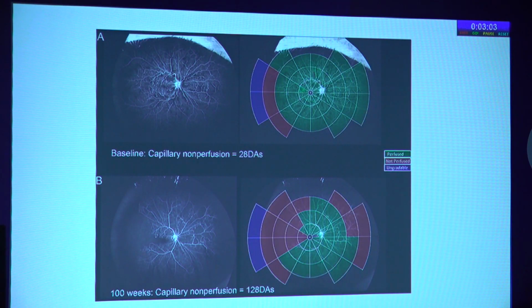Then in cases of central retinal vein occlusion, it is always a debate of non-ischemic versus ischemic CRVO, and the major differentiating point is, apart from clinical features, angiography helps here. Over a period of time, it is called 90 days glaucoma, neovascular glaucoma. If it converts from non-ischemic to ischemic CRVO, then you have to keep on continuously monitoring whether it is converting into ischemic changes, and this can be mapped on the photograph itself to see whether it is progressive or not.